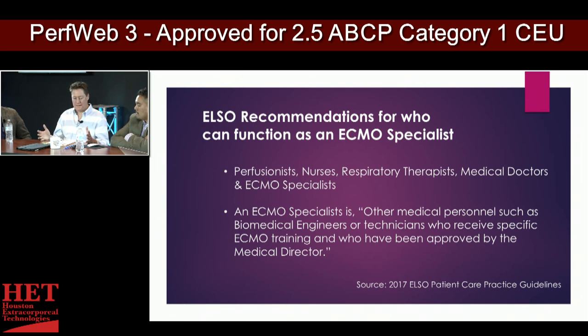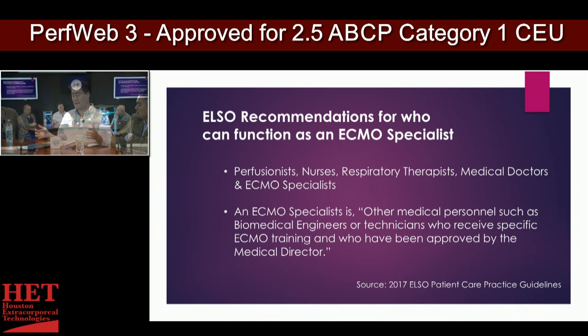So I think that's spooky to me because as perfusionists, we have a certain nature to understand things that we're involved with as far as pressures, and we're used to the profession. Giving that to a biomedical engineer, I think, would be difficult. But this is the standard that is out there, and if we're going to reduce the costs, and if we're going to attack this growing need, this is something we're going to have to embrace. So I think there's a conversation we could have about that.